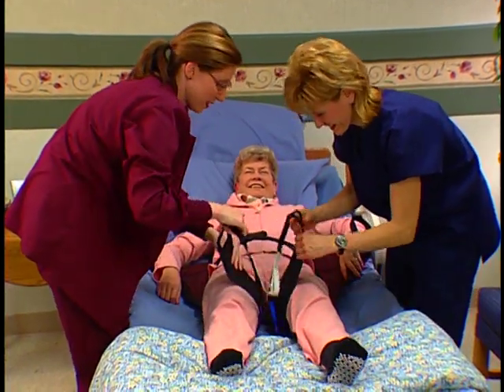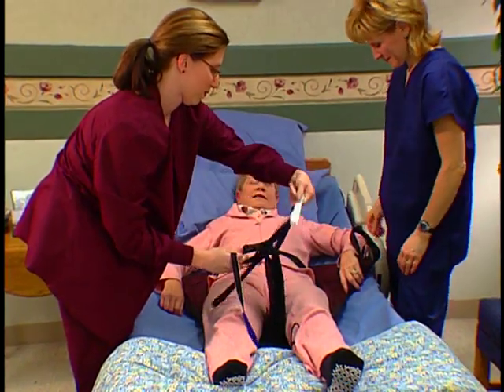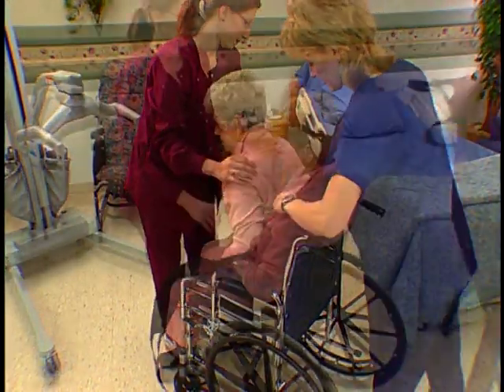Place the safety strap around the resident's upper abdominal area. Fasten the buckle and pull snug. You are now ready to transfer. To remove the sling, simply reverse the previous steps of placing the sling.